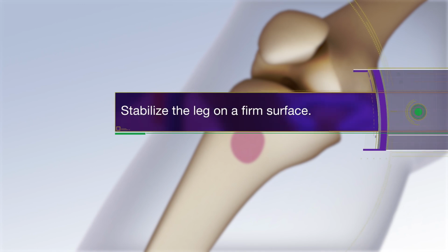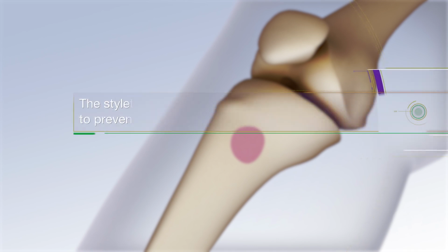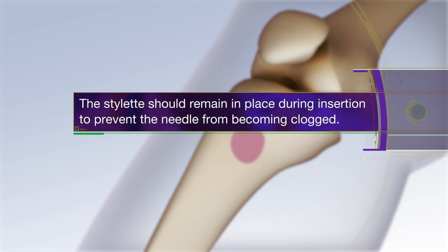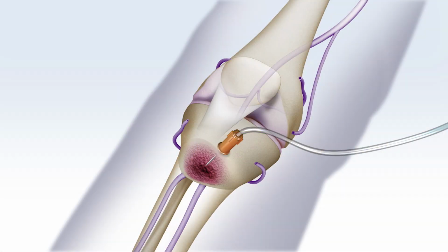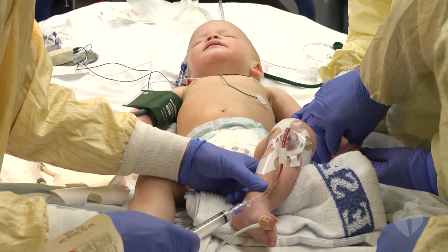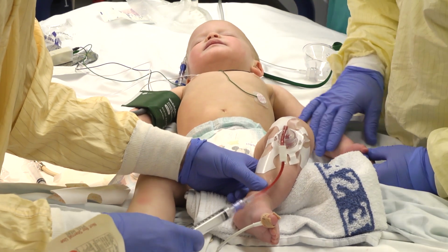Stabilize the leg on a firm surface to facilitate needle insertion. Do not place your hand behind the leg. The stylet should remain in place during insertion to prevent the needle from becoming clogged with bone or tissue. Insert the needle so that it is perpendicular to the tibia. There will be a sudden lack of resistance when the needle is placed correctly, and the needle should stand easily without support. Remove the stylet and attach an empty syringe to confirm appropriate placement.